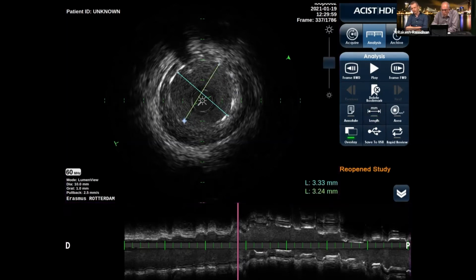So this is a stent without post dilation. This is what you get if you put a 4-0 stent in a fibrotic lesion or a fibrotic part of the vessel. Then you will get some form of underexpansion. So underexpansion is not just limited to calcified lesions; it's also linked to fibrotic tissue. And this is, I think, a very nice demonstration, irrespective of the fact that this was a STEMI patient, on how stents look. And this also illustrates that in this case, it's a 4-0 stent.